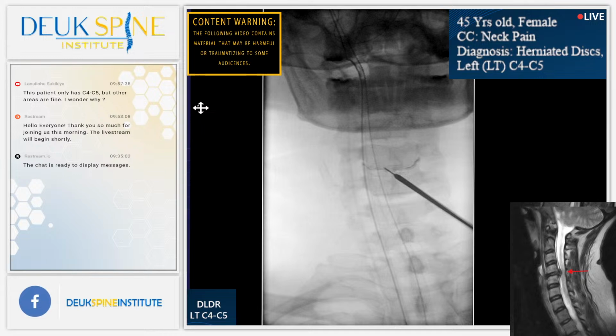By the way, Jordan, show everybody once again. Show them the endotracheal tube. Yep. And the esophageal temperature probe. Yep. Now show us the disc that we're working on. Yes. Show us the tears on both sides. There's the tear on the left. There's a tear on the right. And the dye is leaking out. And the herniation is in the middle, just to her right.